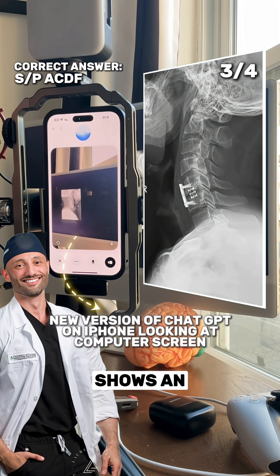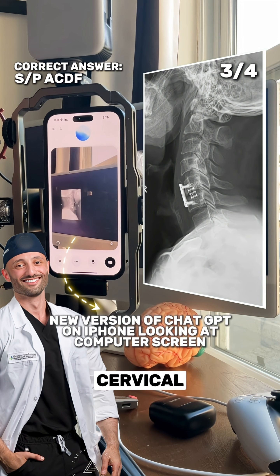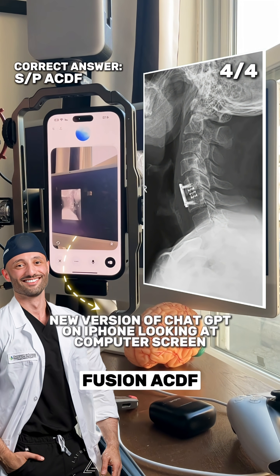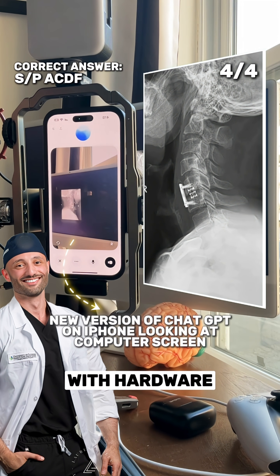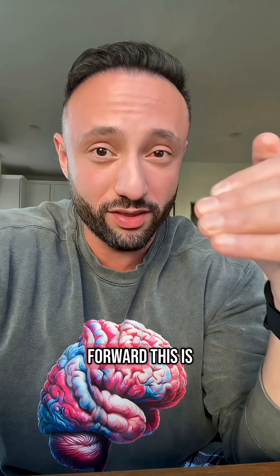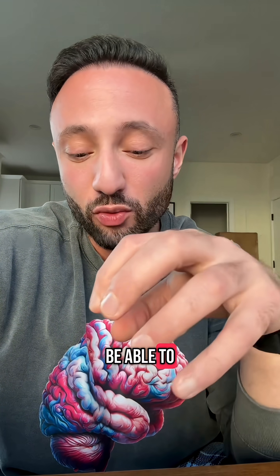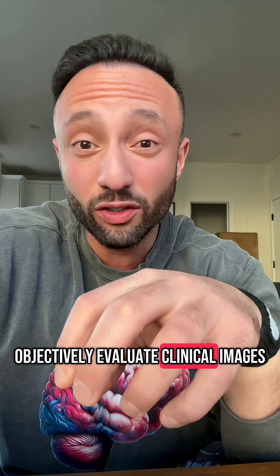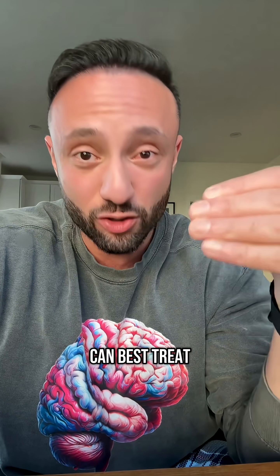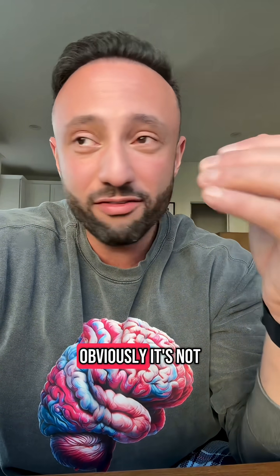What do you see here? This x-ray shows an anterior cervical discectomy and fusion, ACDF, with hardware in place. I can't express how much of a massive step forward this is in medicine — it's going to be able to objectively evaluate clinical images and determine how we can best treat the patient.